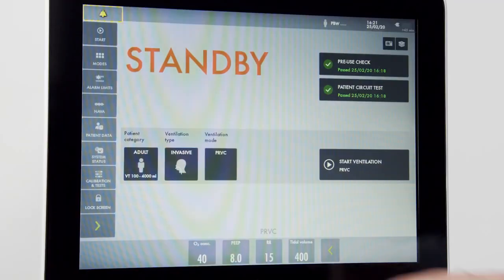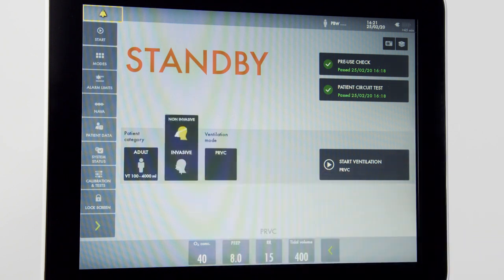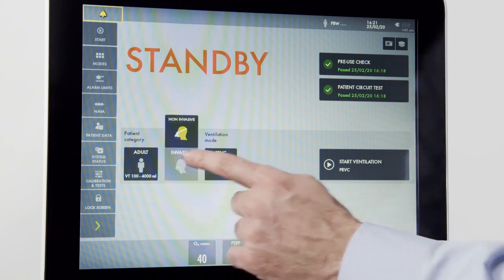For now, we will select adult. In my ventilation type, I can choose invasive or non-invasive ventilation. For now, we will choose invasive.